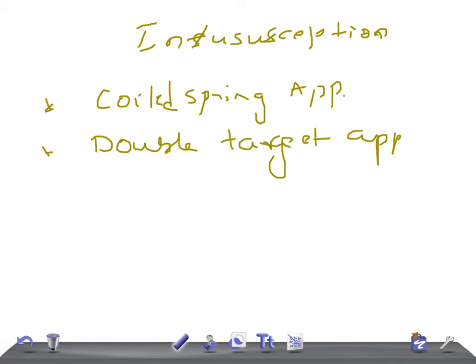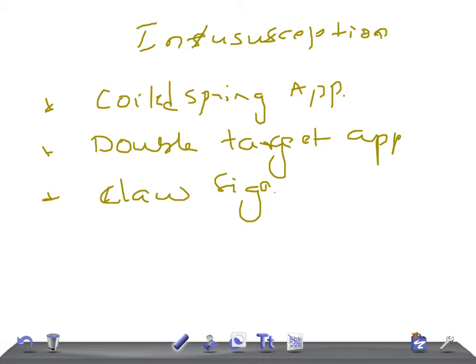Then we have a claw sign. And you know very well that the right iliac fossa is empty, so we call it the empty right iliac fossa. And remember, the barium enema is both diagnostic and therapeutic.